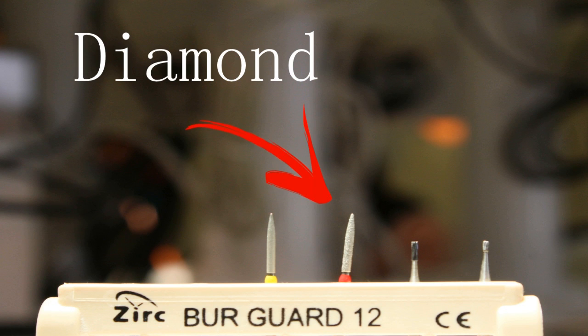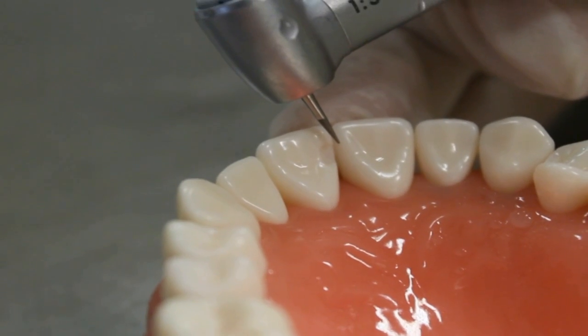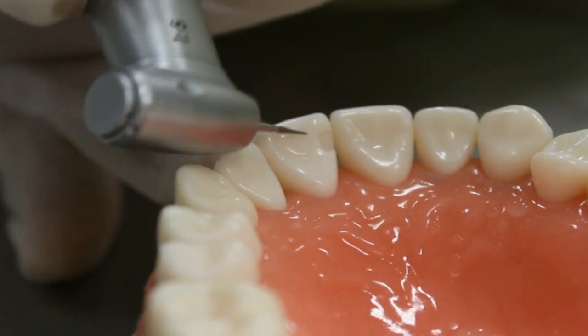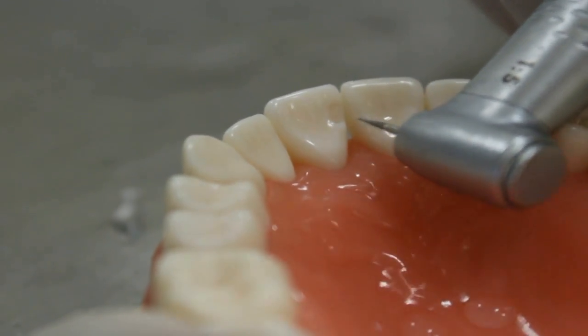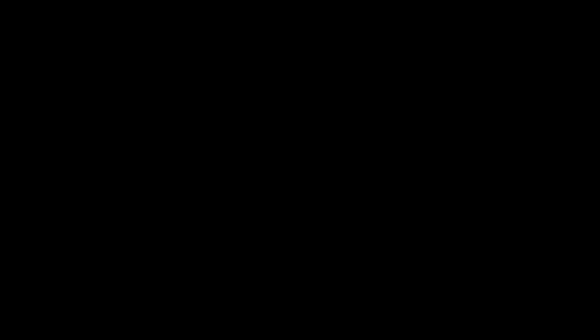Now we move to beveling the margin using the diamond bur. Remember, the direction of the bur should be at 45 degrees. Be careful because it is really thin tooth structure, so we don't want too wide a beveled margin — small is enough. Here we did not turn on the handpiece because we want you to see clearly how the direction should be.